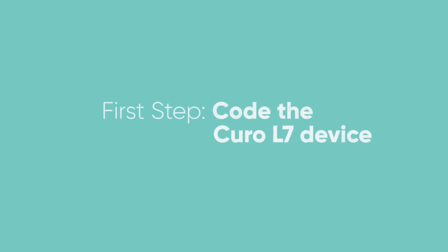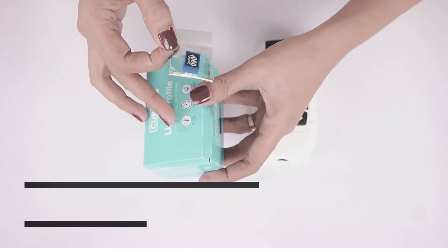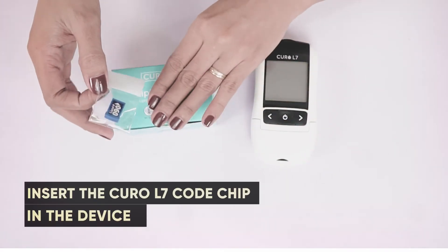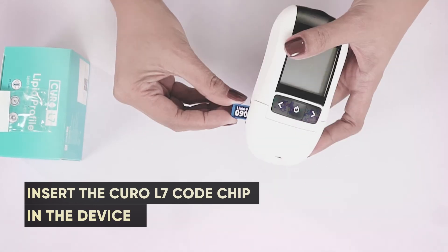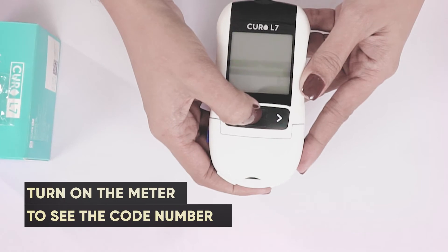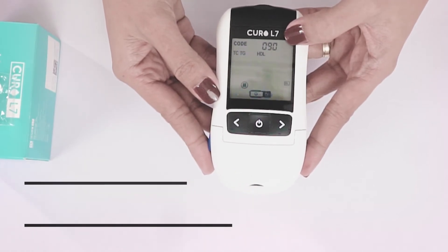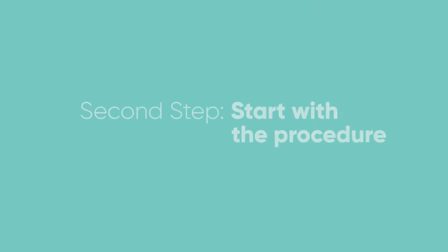Inside the profile test strip box, you will find the code chip. The first step is to code the device by inserting the code chip on the left-hand side of the meter. Turn on the meter and you will see the code number displayed on the screen with a flashing test strip symbol.